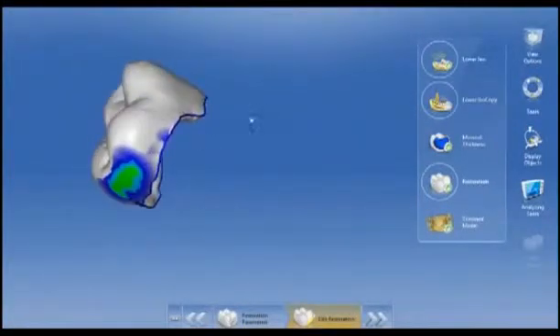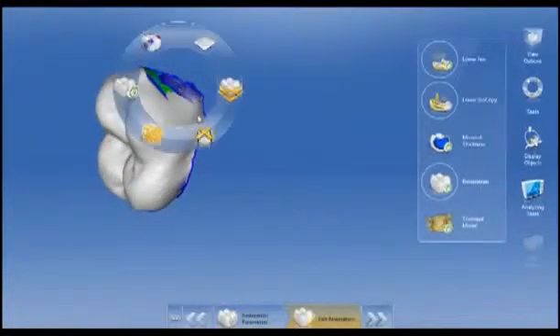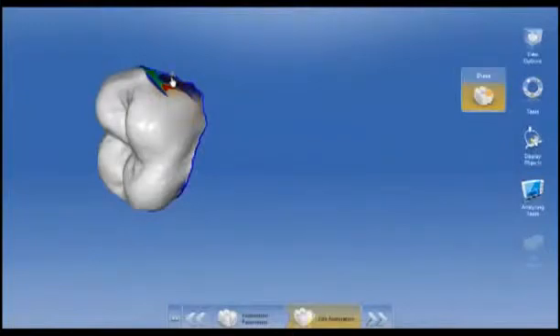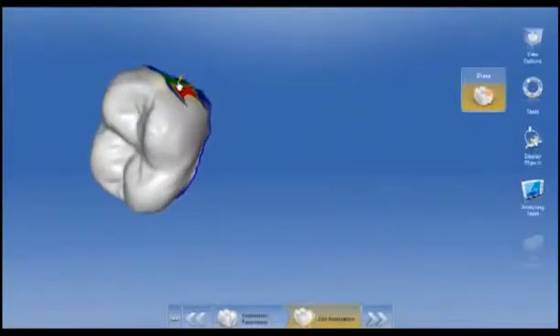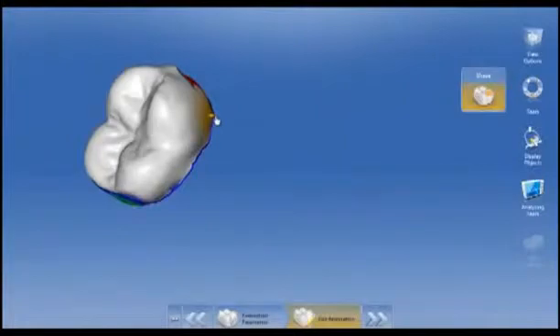The proposal is completed, and now we just need to tweak it a little bit. So I'm going to make the emergence profile towards that distal lingual a little bit better. I'm making it a little bit fatter here. Now I know it looks a little rough. I'll smooth that out in just a second. But I wanted to give it a nice contour for that gum tissue to rest up against.